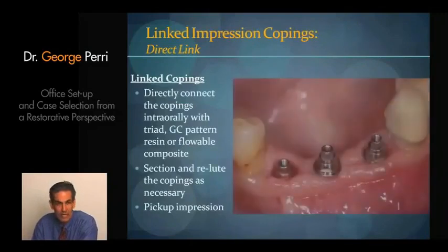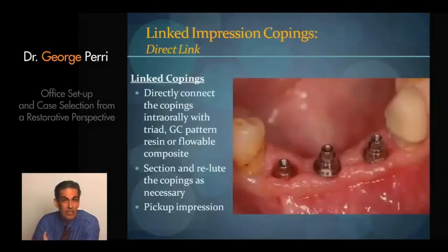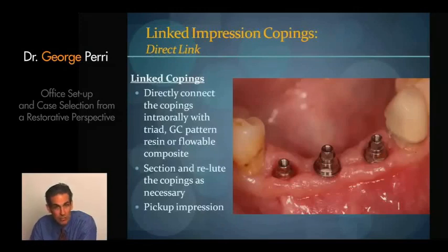Here's an example of a case with, let's say, multi-unit type abutments. There'll be a gold cylinder and a restoration above that. In your mind, do you feel it's necessary to do anything other than put in closed tray impression copings and take a quick impression? I would tell you, even if you were choosing a different kind of abutment and doing cemented, separate crowns, I would still put a little bit of effort into the master model because it'll make everything go faster and more predictably as we finish the case.